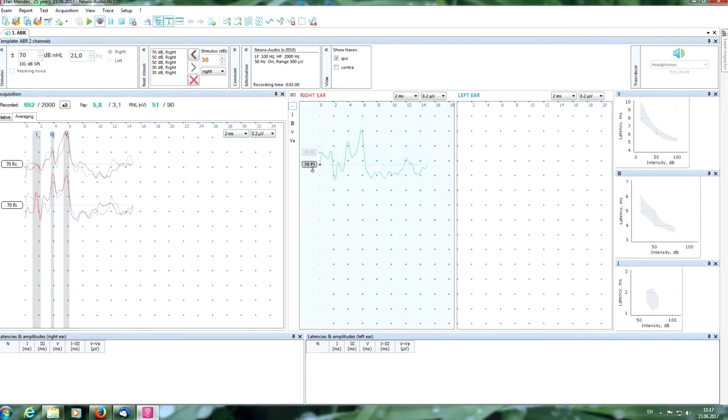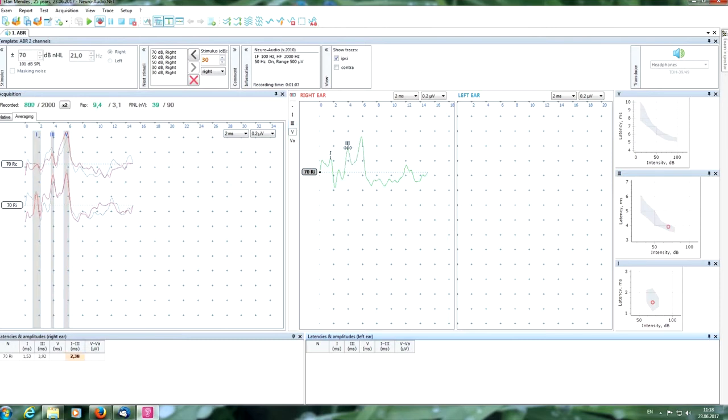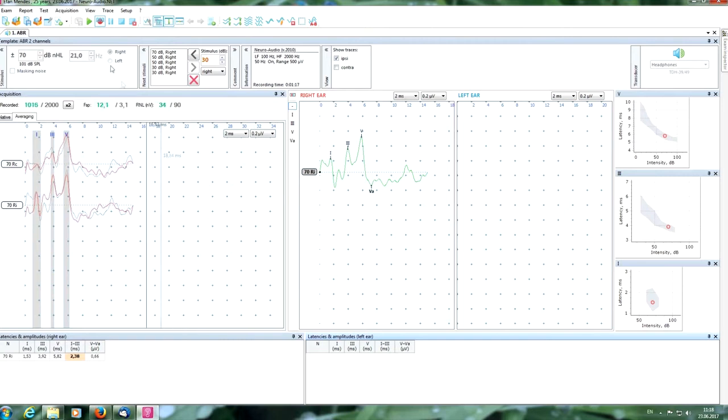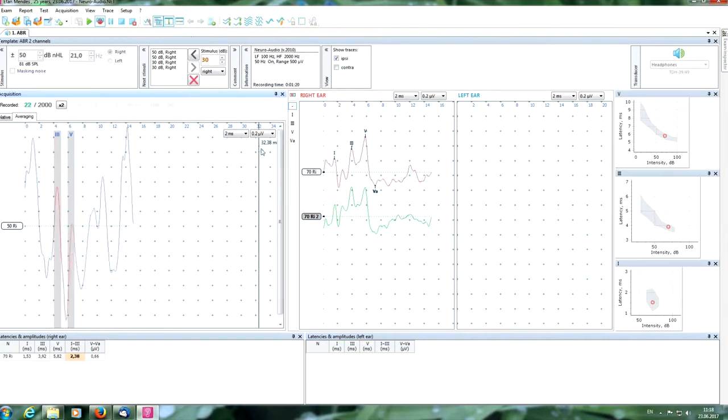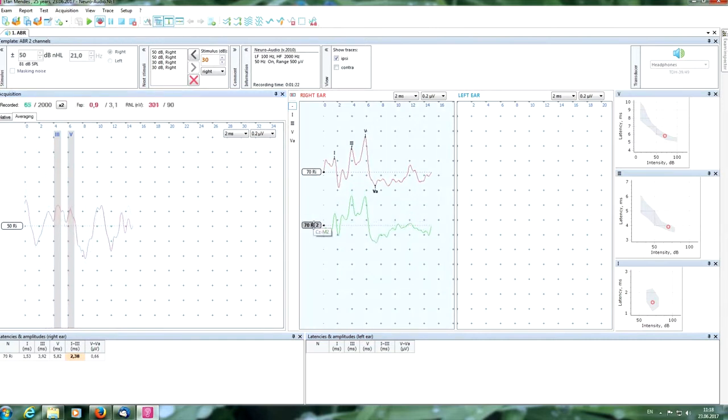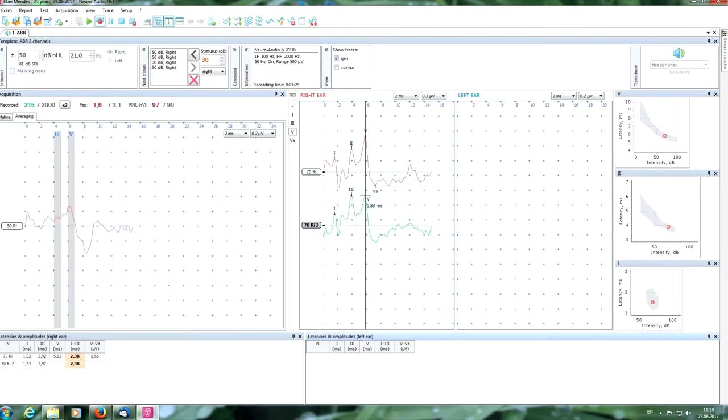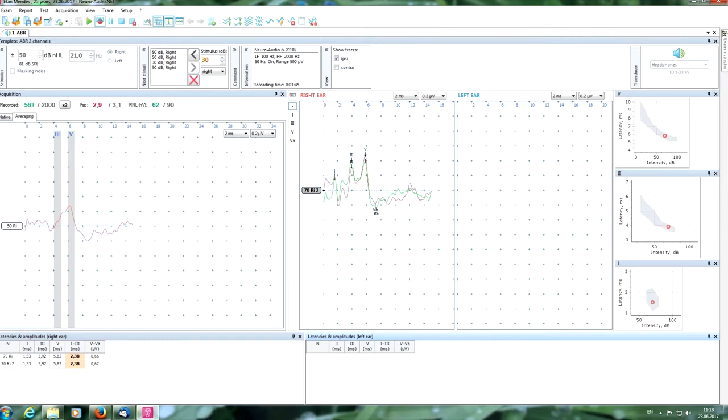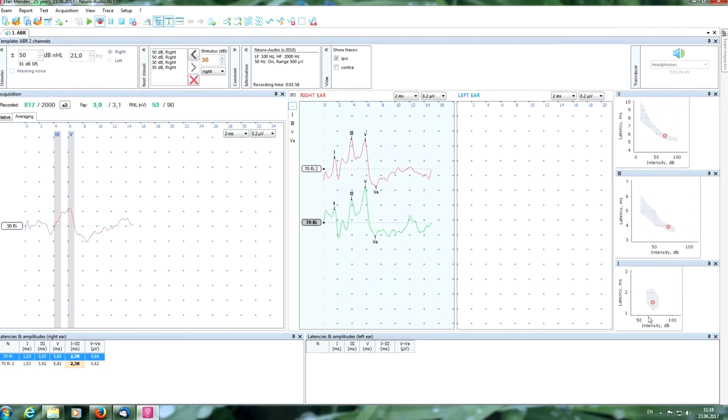Now you can put necessary markers. The first wave. The third wave. The fifth wave on the curve. Now we get the second response. It is good. Higher reproducibility as you can see. We can manage the second curve. Put the markers. If we want we also can overlay our curves to check the reproducibility. Also we can see latencies and amplitudes here in this table and here in the graphics.